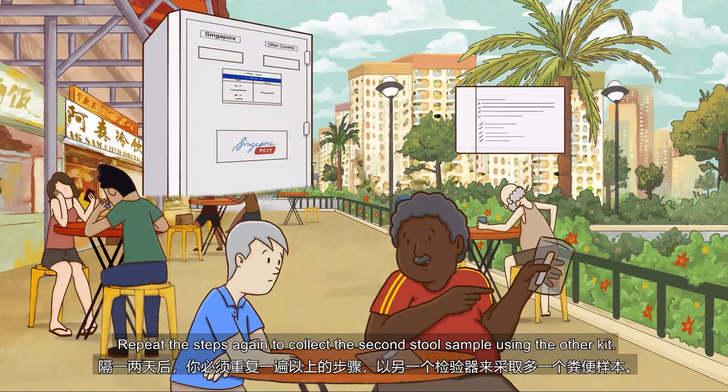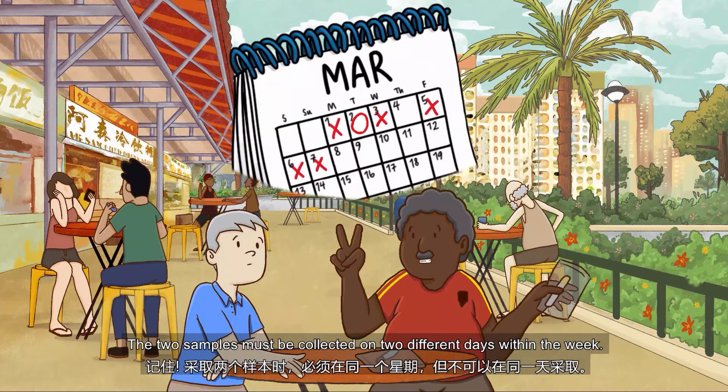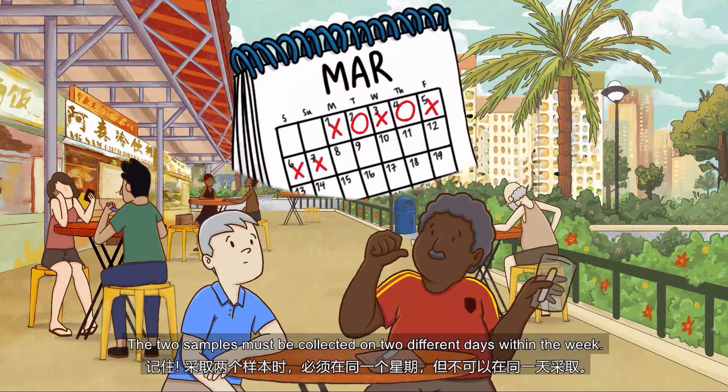Repeat the steps again to collect the second stool sample using the yellow kit. The two samples must be collected on two different days within the week.